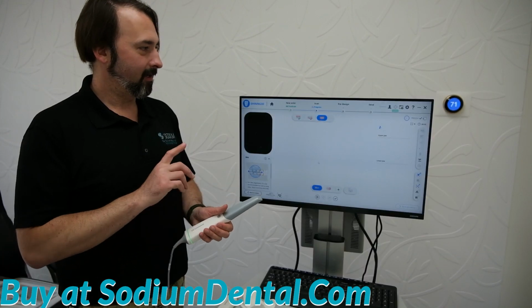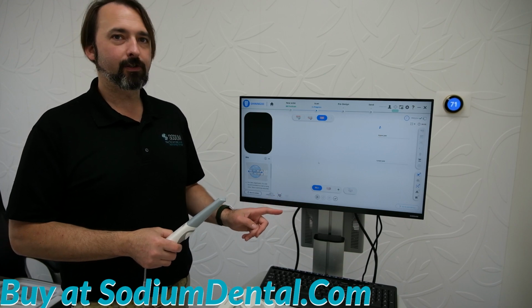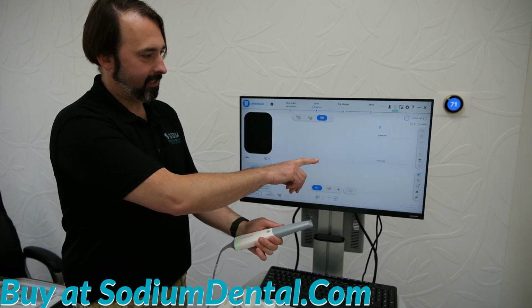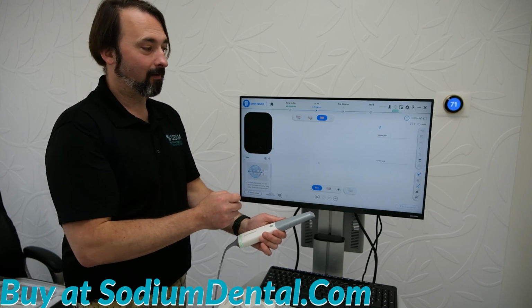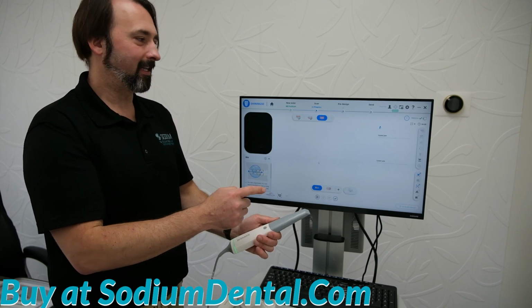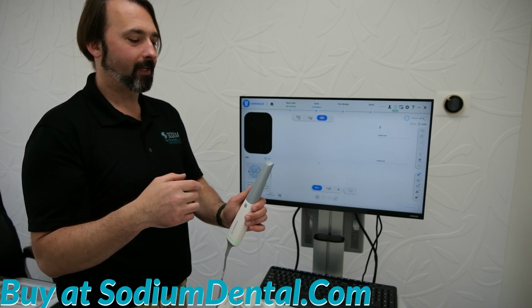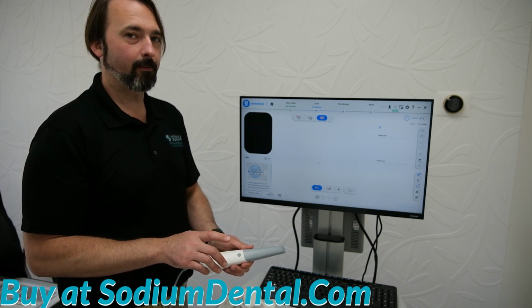Now, to begin the bite scan. You can see here, we are first going to scan the right side bite. With the scanner off, you can see that the reticle is not up on the screen, the red square or reticle. You want to insert the camera into the patient's mouth, into the buccal space, have them bite down fully, then press the scan button to start your bite scan.